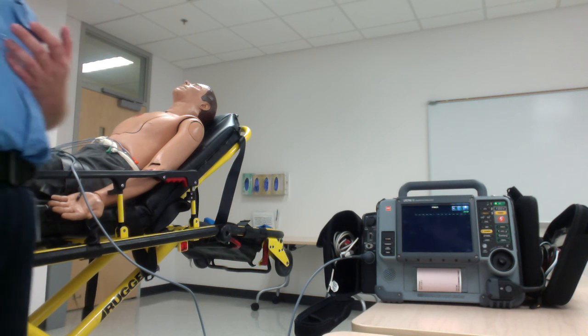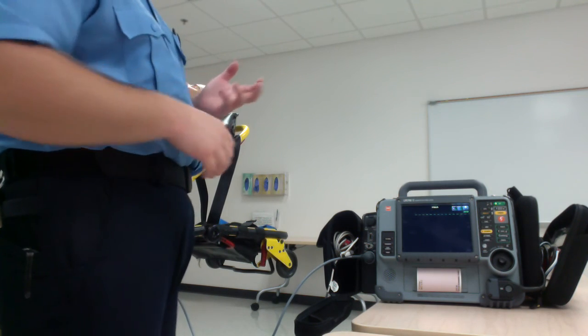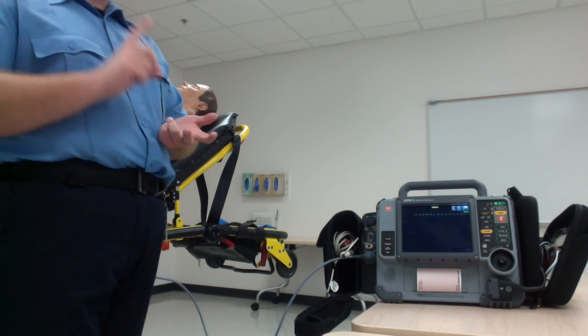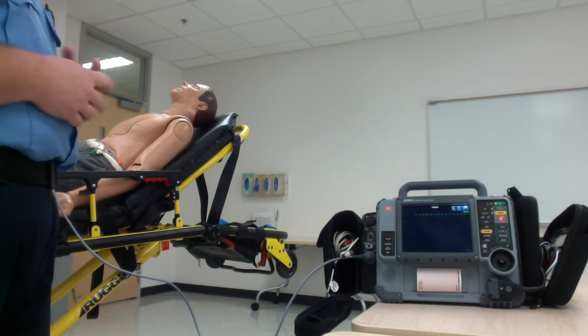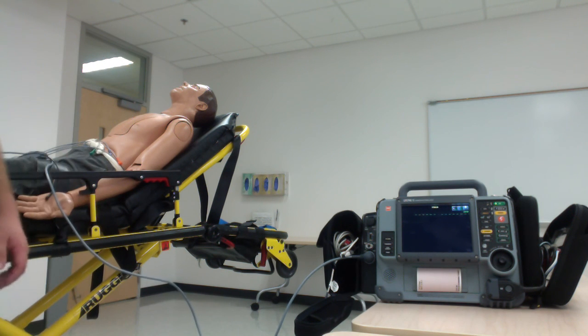Those boxes there where it gives you the readout, what it thinks is going on. The monitor has its own system for computing. Okay, I think the patient has this, this, and this wrong with it, based on their age and their gender. A lot of times they'll just say abnormal findings, for example, 40-plus-year-old male, and it'll say something's wrong, but I don't know what's wrong.